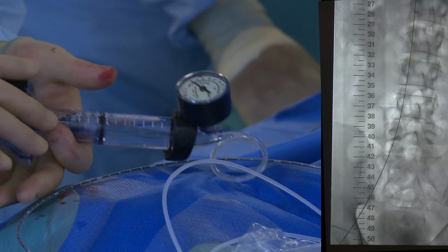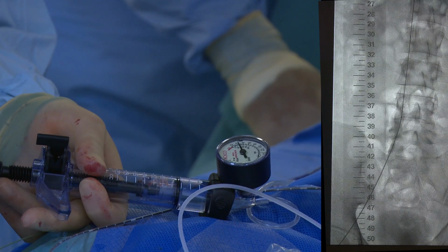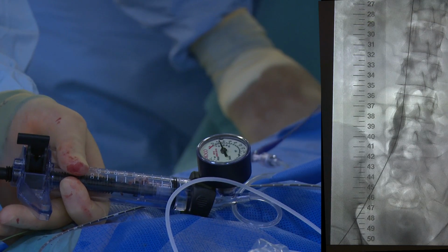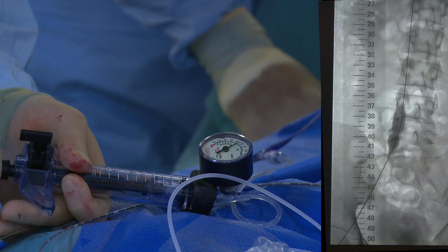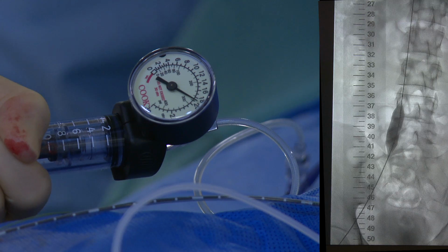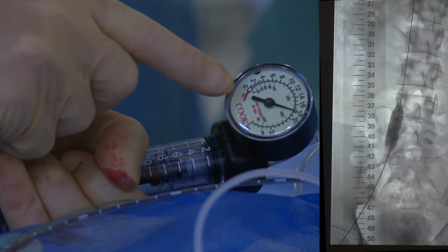Pre-dilatation with a high-pressure, non-compliant balloon catheter is performed prior to stenting. The entire diseased segment of the vein is dilated. Pre-dilation can be performed directly with the final size balloon. Once the balloon reaches full dilation, the pressure gauge demonstrates a gradual reduction in pressure, indicating the fibrotic tissue has been disrupted.